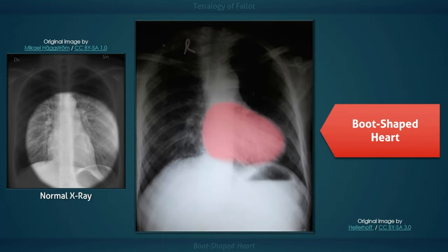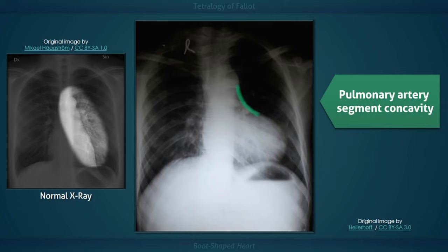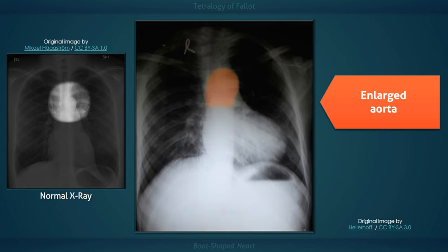The term boot-shaped heart refers to the abnormal appearance of the cardiac silhouette seen in tetralogy of Fallot. Two of the four classic defects are a ventricular septal defect and pulmonic stenosis. This combination results in elevated right ventricular systolic pressure with ensuing right ventricular hypertrophy — a third defect. In this radiograph, right ventricular hypertrophy has resulted in an upturned cardiac apex positioned abnormally high above the diaphragm. Pulmonic stenosis can also result in a small main pulmonary artery due to decreased flow, depicted on x-ray as increased concavity of the main pulmonary artery segment.